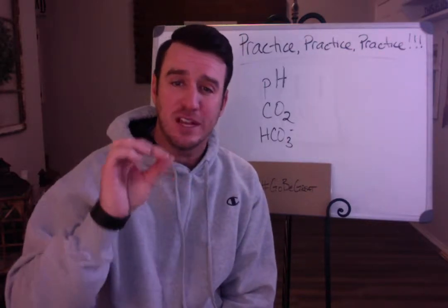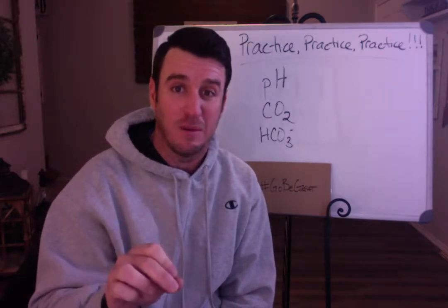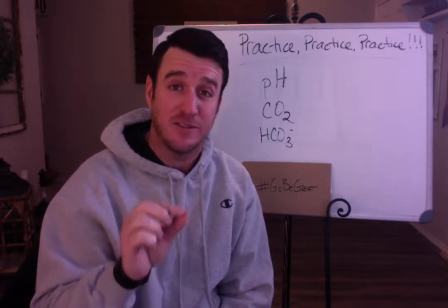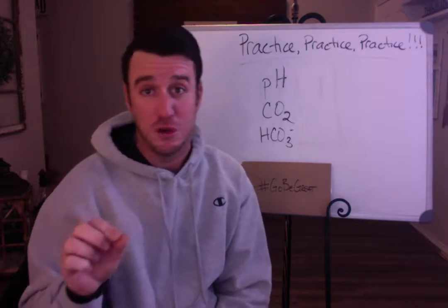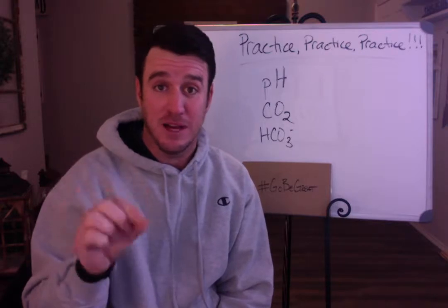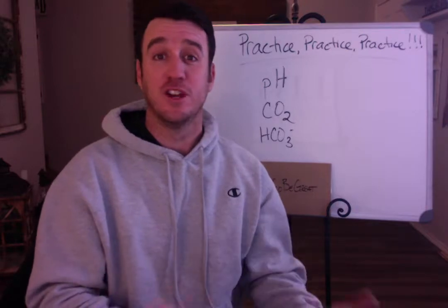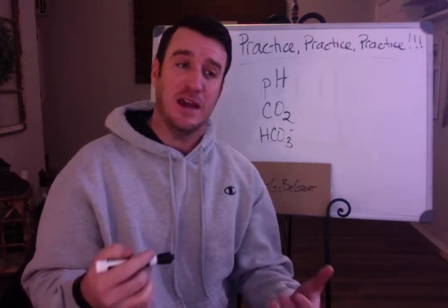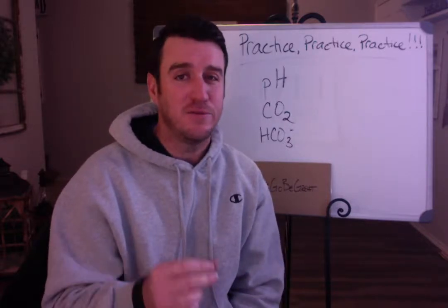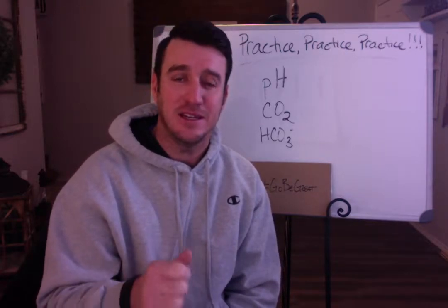Now, a lot of people use arrows to interpret blood gases, and I don't have a problem with that except for the fact that I have a problem with it. If you're learning how to interpret blood gases based off of arrows, these two arrows go up, these two go down, this one goes up, this one goes down, then you're learning more on how to just interpret when all the numbers are there in front of you and you have a perfect scenario, okay? But it doesn't really tell you if you're really understanding what's happening in the body.